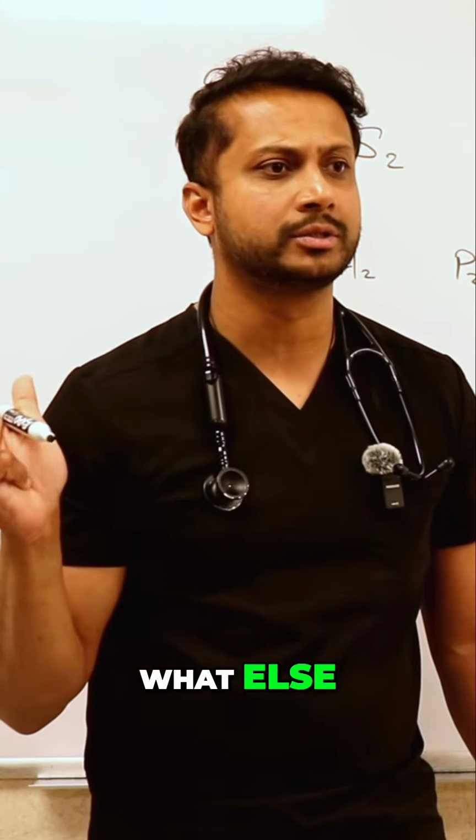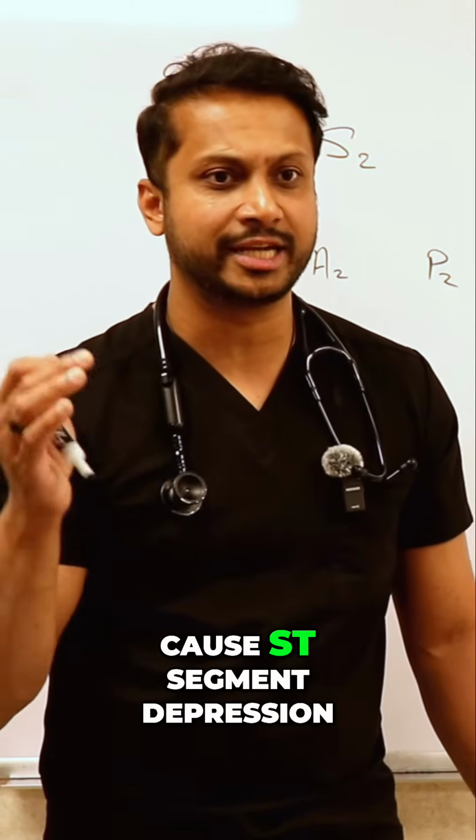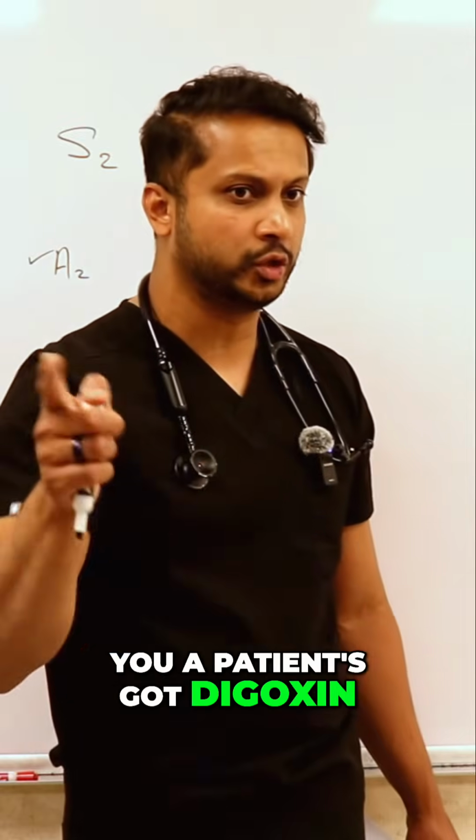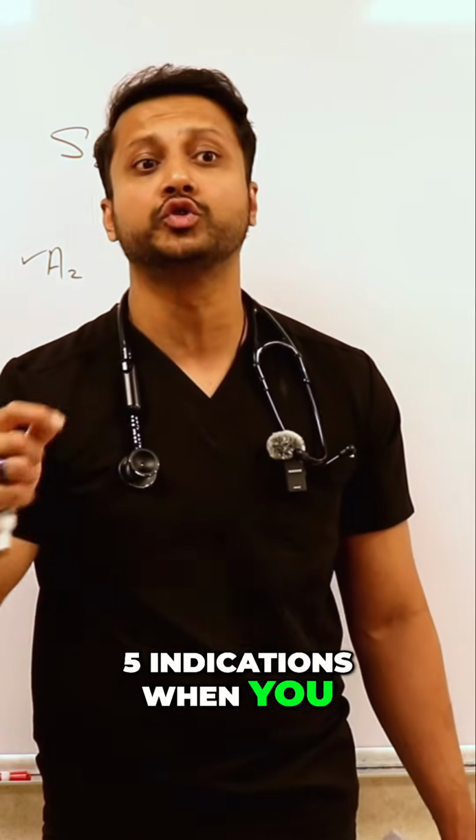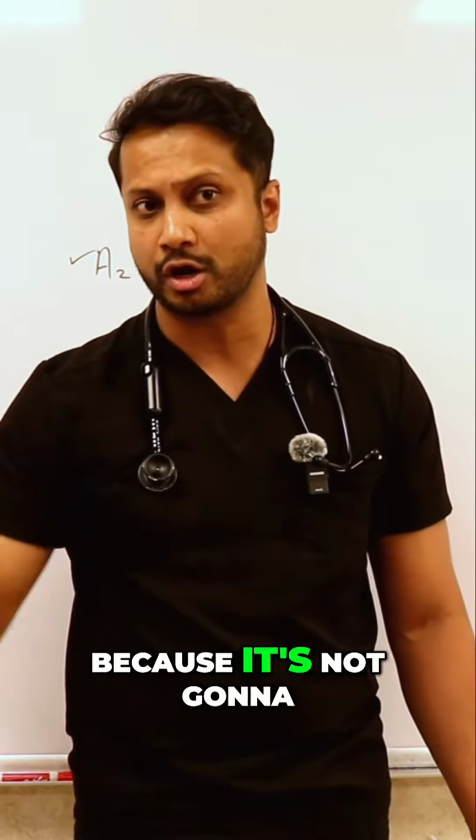What else? What if somebody's on digoxin? Digoxin, because it actually can cause ST segment depression. So if they tell you your patient's got digoxin, look for the EKG, you can have ST segment depression. So those are your 5 indications when you should not do an exercise EKG because it's not going to be readable.